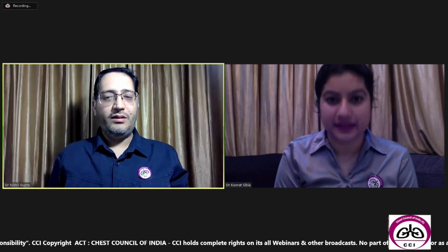For example, fat is the greatest mimicker: pericardial fat, subdiaphragmatic fat, or fat above the diaphragm. It is the biggest mimicker of silhouette sign. Also, an azygous lobe fissure can mimic it. Sternal abnormalities, like a depressed sternum, can also look like a silhouette sign. And some AP views can be in such a difficult position that they can obscure the lung borders. So that's a very valid point.